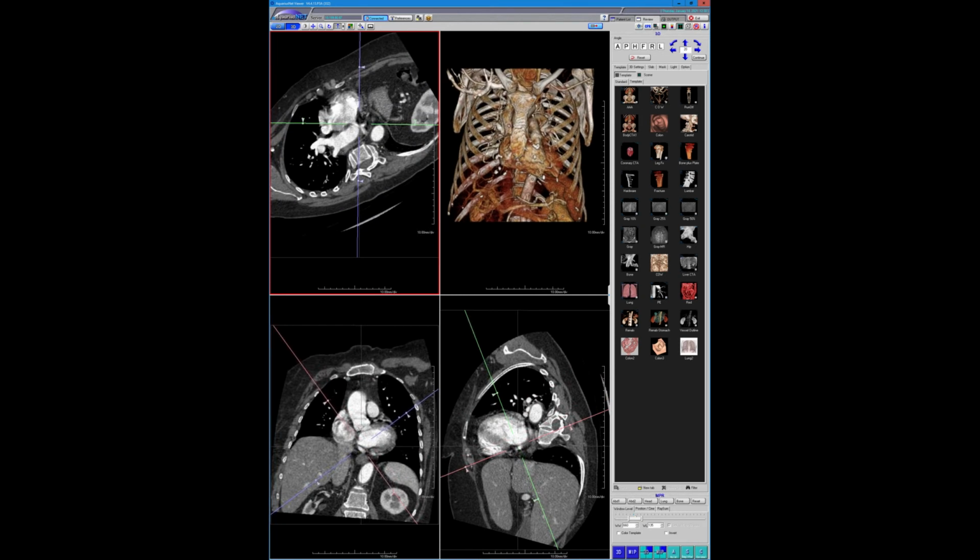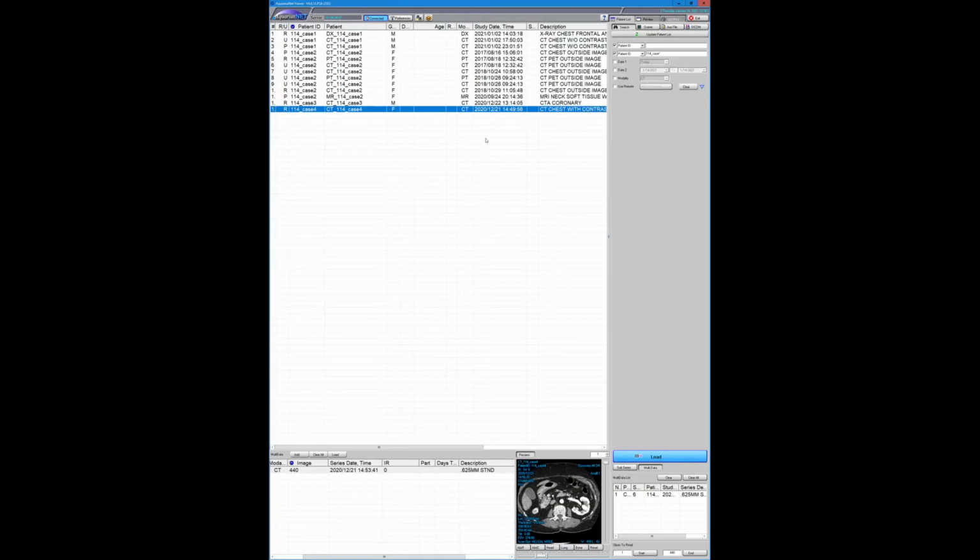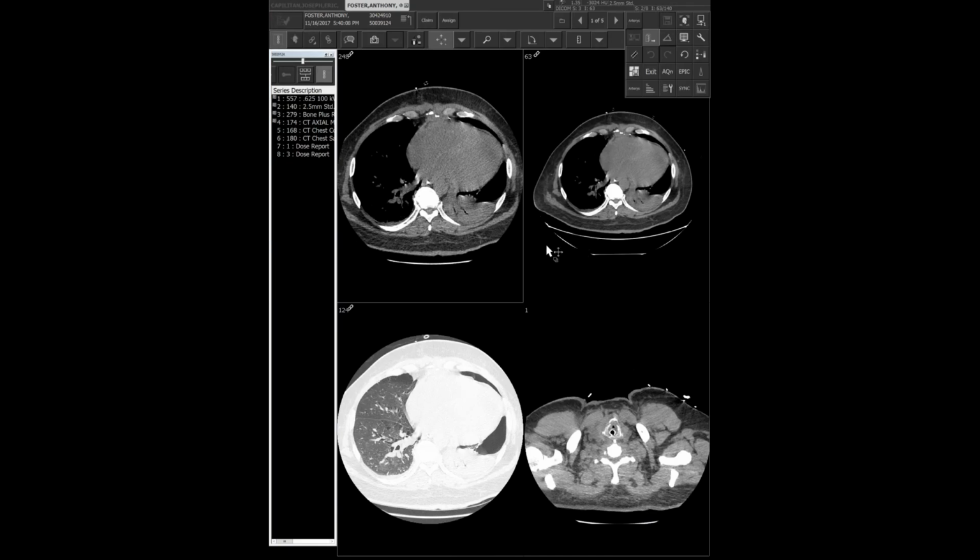I have to pull it up. I showed one maybe, God, it's sad, like 9 years ago now, 8 years ago now, that was a gated study. But that's the only one I've ever seen on a gated study, because I've probably got 4 or 5 of them, and you've got a few. I think it's an important finding just for that reason to recognize.